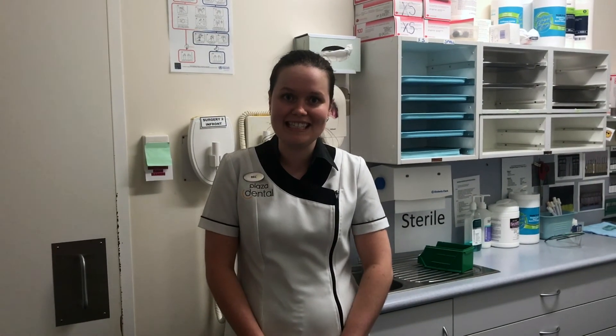Hi guys, my name is Bec and I'm just one of the dental assistants here at Plaza Dental. Today I'm going to be taking you through some of our basic sterilization procedures.